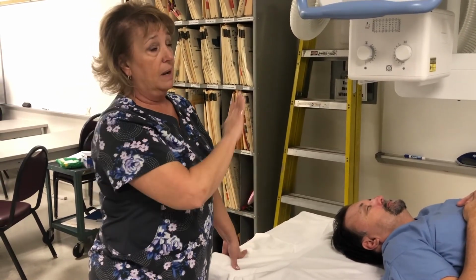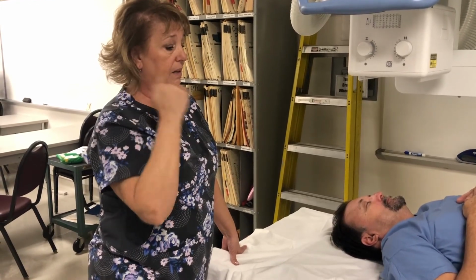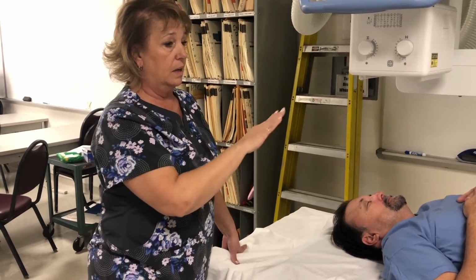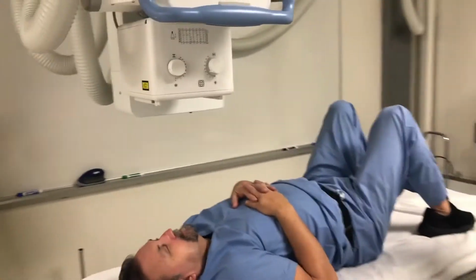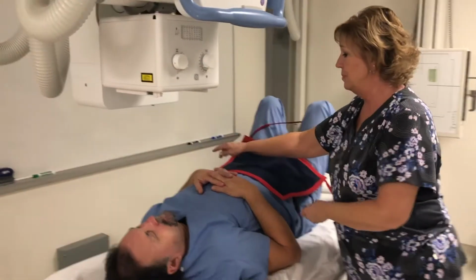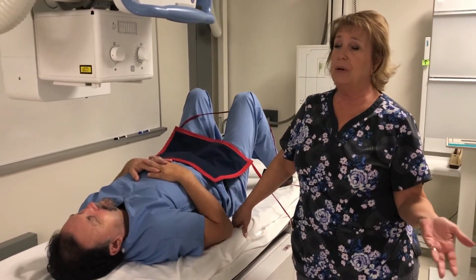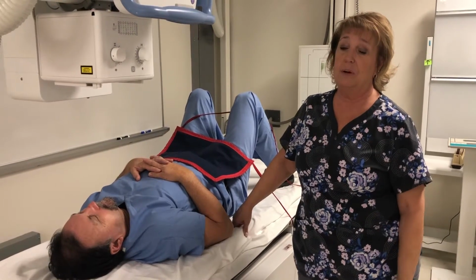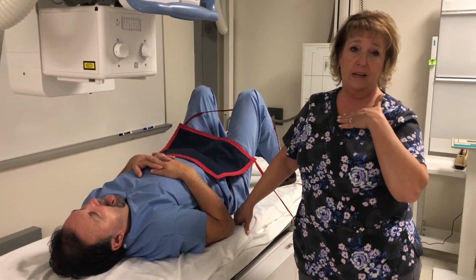So you're going to want to be completely set up for this. Get your occlusal plane perpendicular, make sure your collimated marker's on, shielding is on, everything is set to go. And right before you go to take the exposure is when you're going to have them open their mouth. The book recommends that you also have them phonate, which is say, ah, because it drops the tongue out of the way.